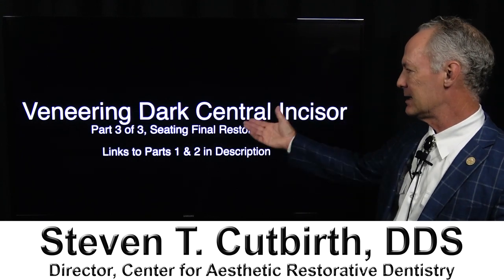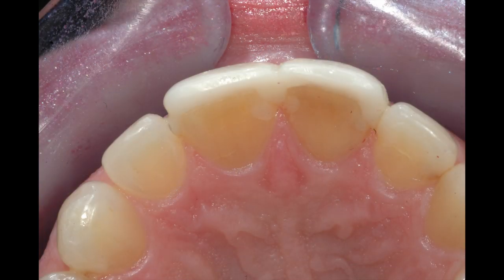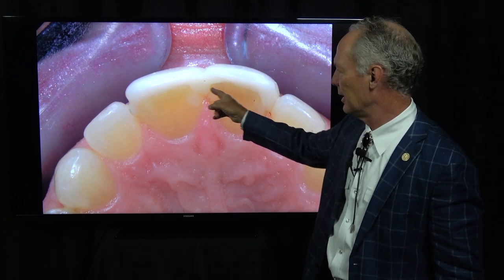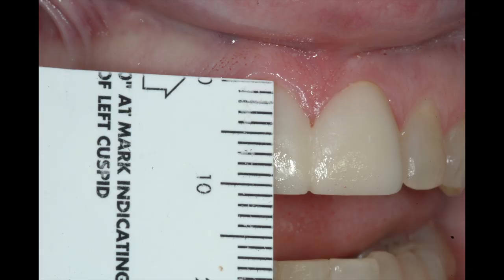This is part three: seating the final restorations when you're veneering a dark central incisor. As we discussed, this is a brutal case. There's hardly anything worse than restoring a dark central incisor. I never restore just one central unless it's somebody that's not particular about appearances. If it's somebody particular about the way things look, I always restore the adjacent central, even if there's nothing wrong with it — because you're just not going to be able to match that tooth if you're not restoring both of them.